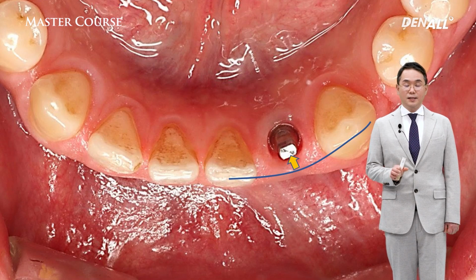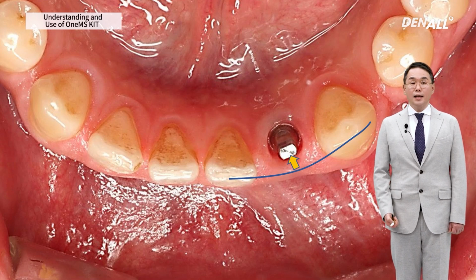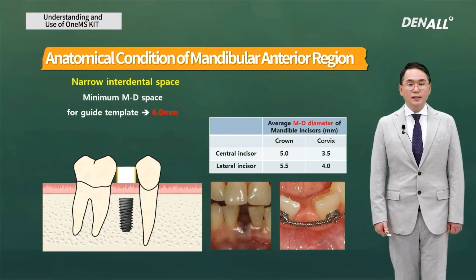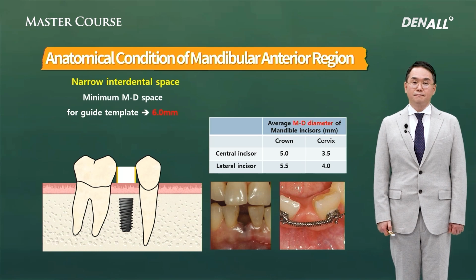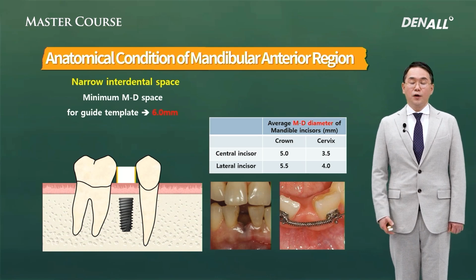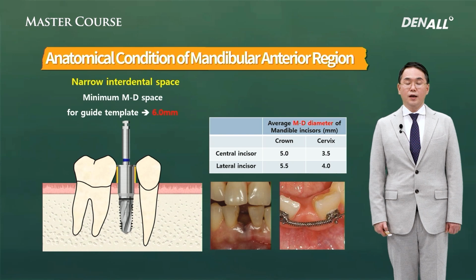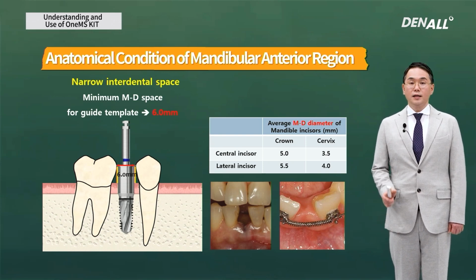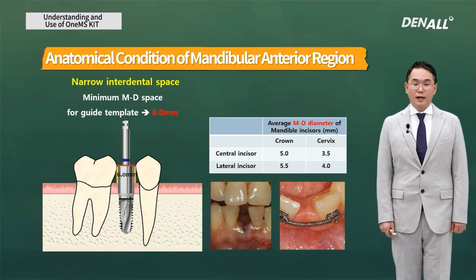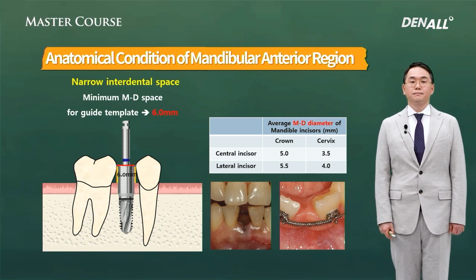When the mesodistal distance is short and the bone width is narrow, it is not easy to place an implant, but you can get help from the guided surgery. To apply the OneGuide system, there is a disadvantage. The OneGuide drill in the OneGuide kit has a stopper diameter of about 6 millimeters. So to use the OneGuide kit, the mesodistal diameter should be at least 6 millimeters. And we need to consider the thickness of the guide hole, so it should be thicker.